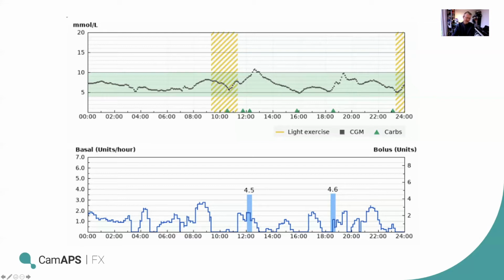And where it's going down to about where the mouse is now, I would have done exactly what Helen was just talking about and set my low blood glucose alert to trigger at about 5.6. So I would have had that alert, had a few wine gums to turn the trend around. And then as I saw the graph start to climb again, I switched off ease off just after 11 and left the algorithm alone from that point to get on with things, which it did very well.